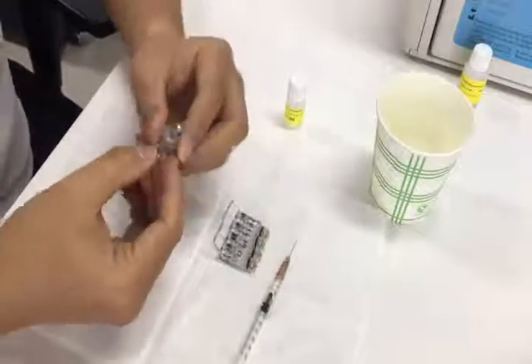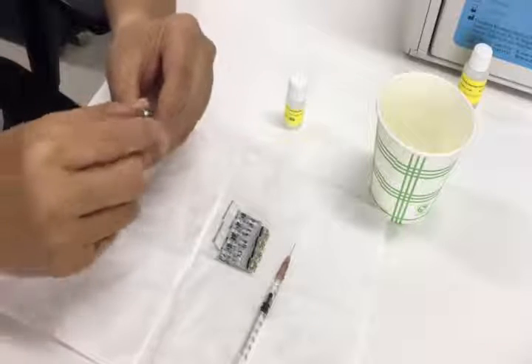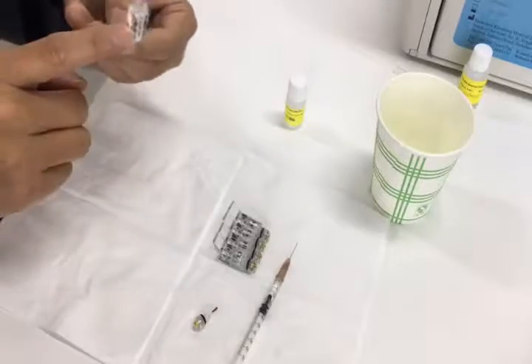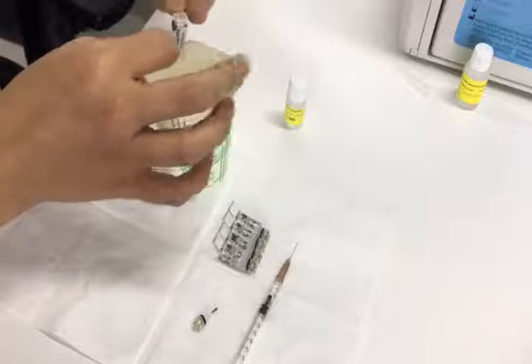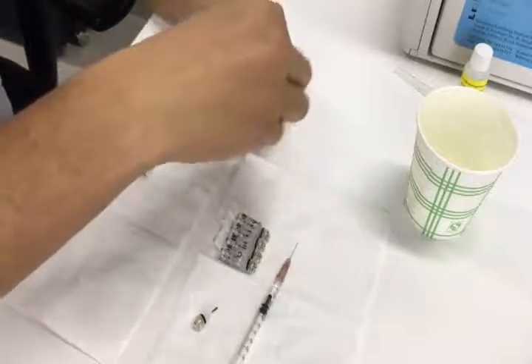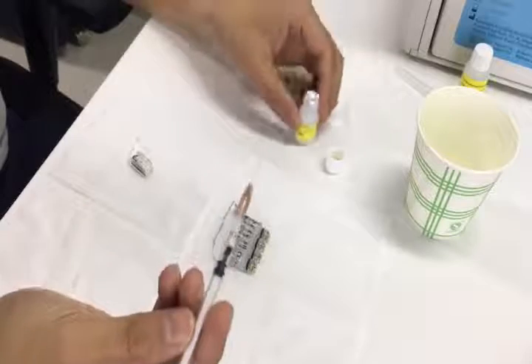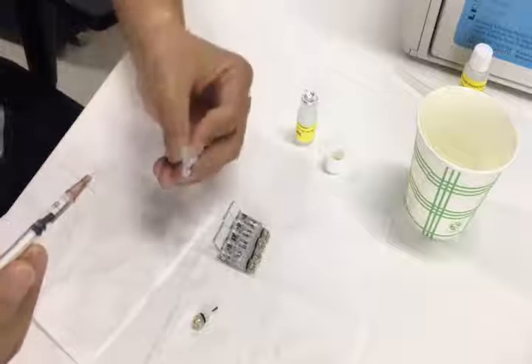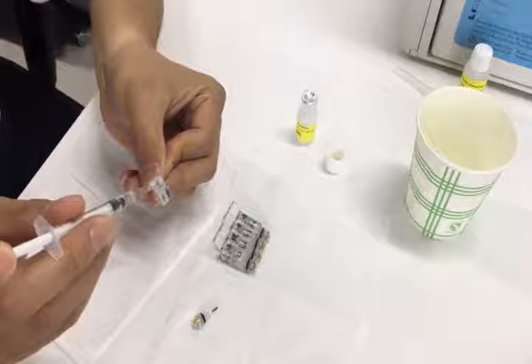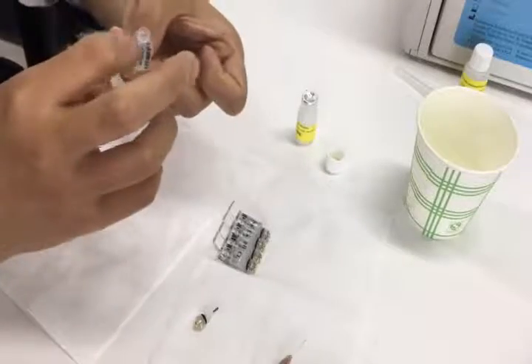Next, let's change the electrode solution for the smaller one, taking potassium as an example. First, we need to remove the cap of the electrode and remove the solution out. Use a new syringe to take the solution from the small bottle, and add part of it into the electrode first for cleaning. Please push the syringe slowly.